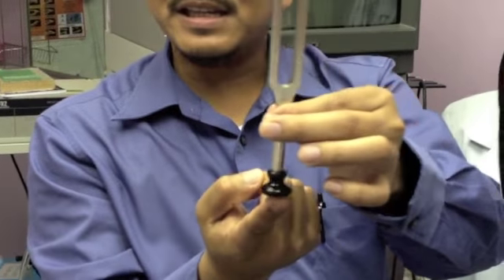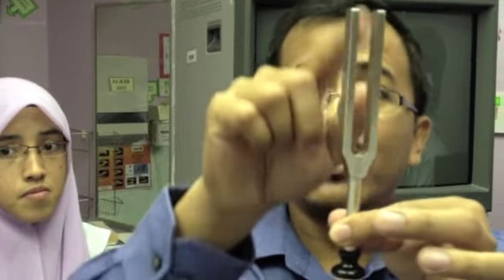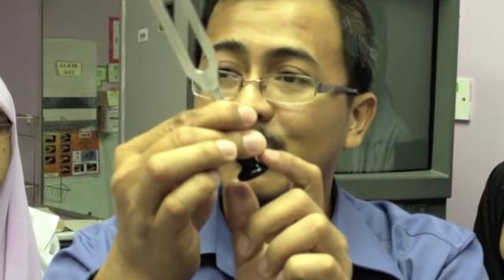Okay, come. Okay, this is a tuning fork test. Let me introduce you to the tuning fork. This is the base. You don't put like this. This is the handle. This is where you hold it. You don't hold here, you hold here. This is the flange or the fork or whatever you want to say. This is where the vibrating part is. It's not here, it's here. Alright. So first, Rini.